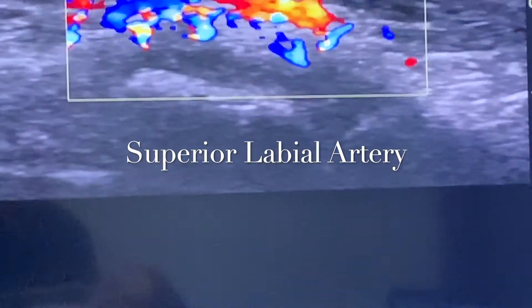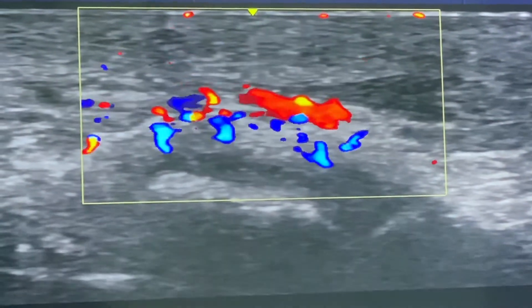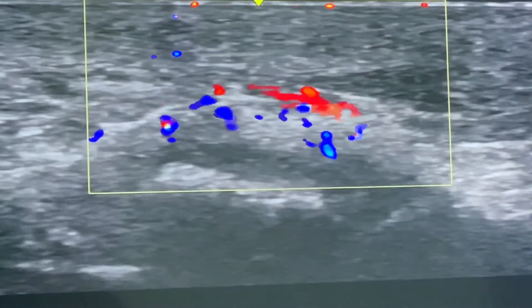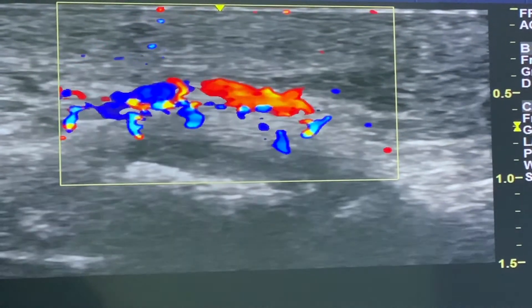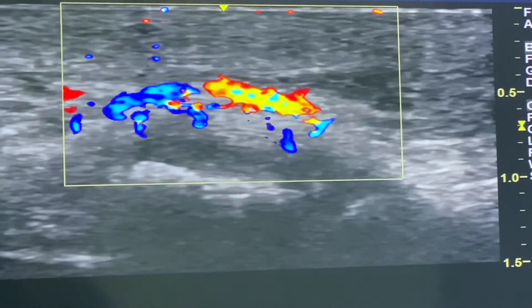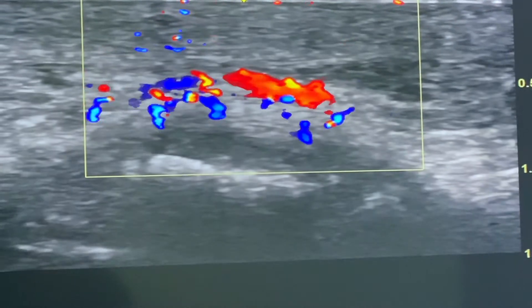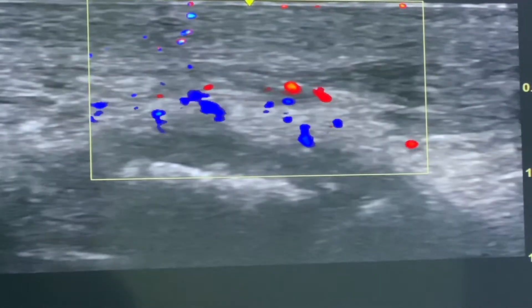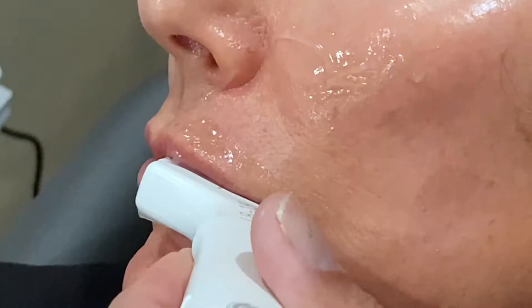What we're looking at now is the superior labial artery, which is deep to the orbicularis oris muscle — that's the darker area you see more on the right side. This is a typical positioning of the superior labial artery, and the injection should take place superficial to the orbicularis oris muscle to prevent inadvertent injection into these arteries.